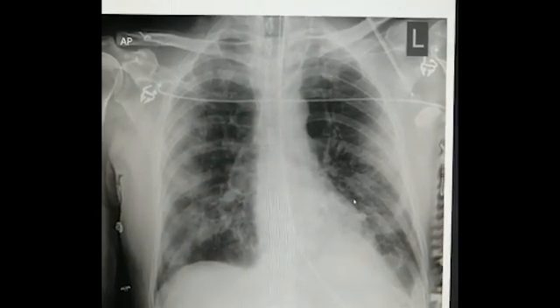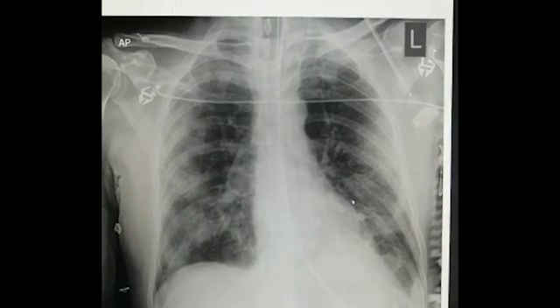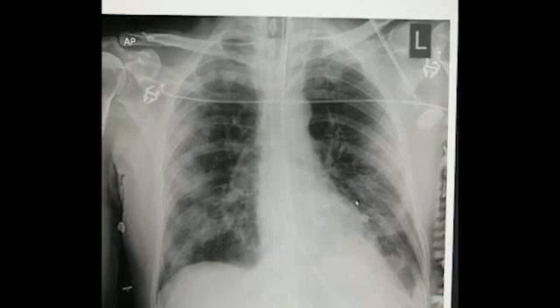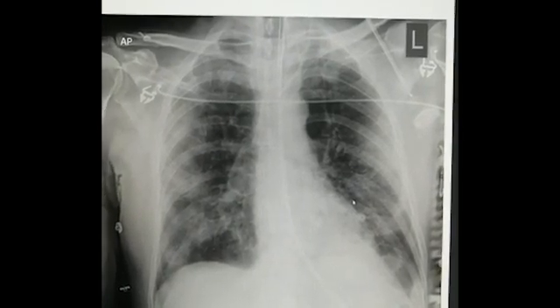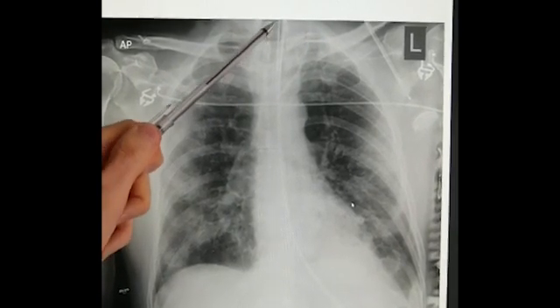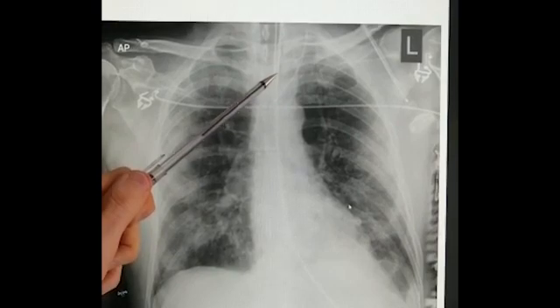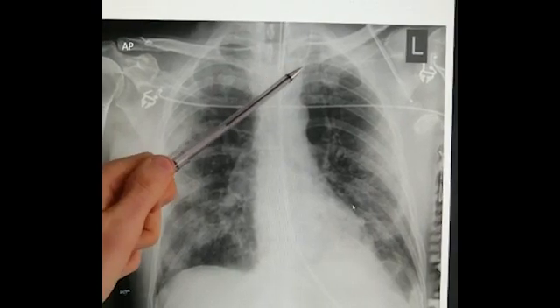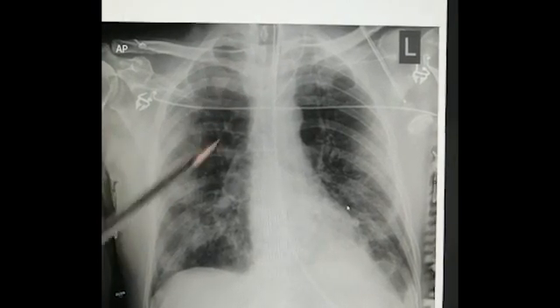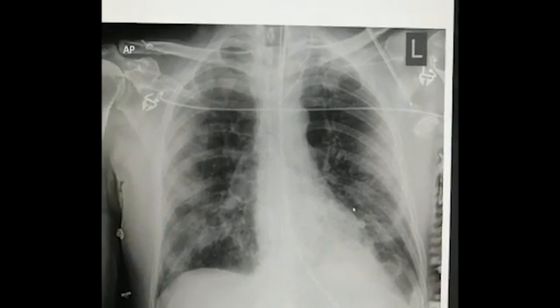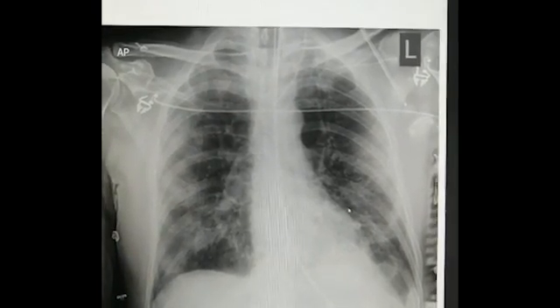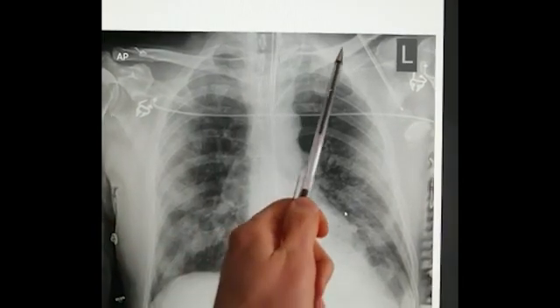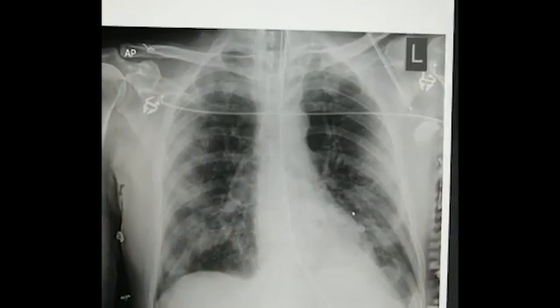A lot of the x-rays will be to check ET tube positions. ET tubes can be difficult to find, but we've got an ET tube here just projecting below the clavicles. Sometimes we're putting subclavian lines in, and these are more visible under the clavicles.